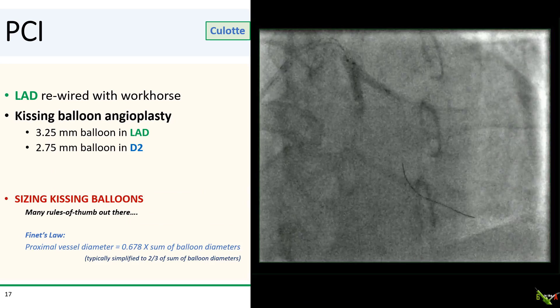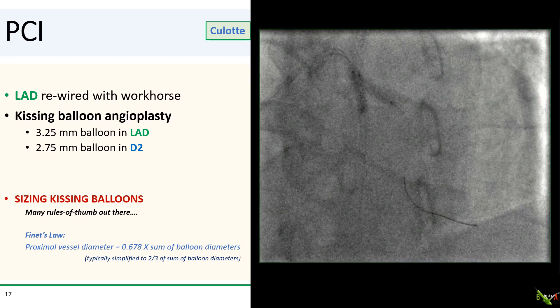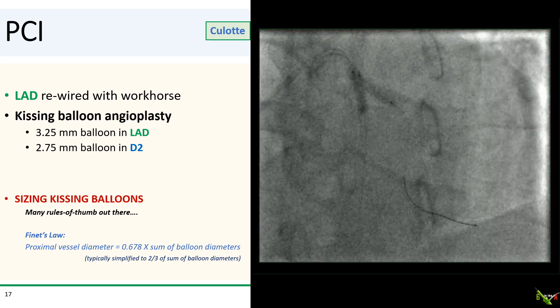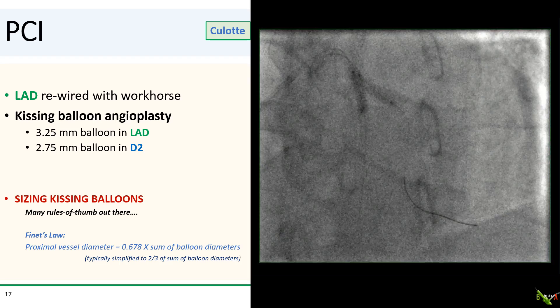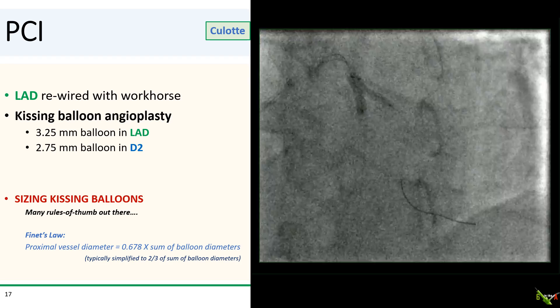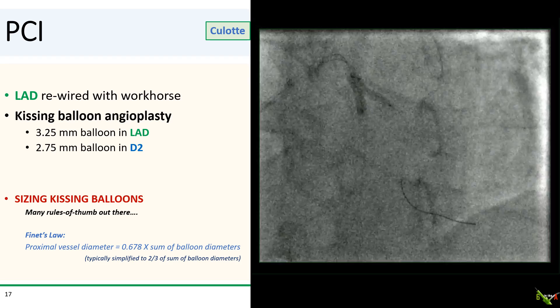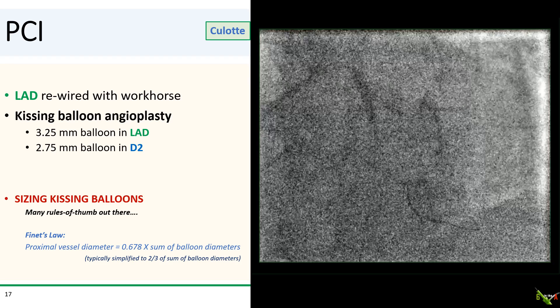After rewiring the LAD with a workhorse, we did kissing balloon angioplasty with a 3.25 mm balloon in the LAD and a 2.75 mm balloon in D2. How did we pick those sizes for the kissing balloons? There are many rules of thumb, but the most common one is probably the two-thirds rule, which is derived from Finet's law, which states that the proximal vessel diameter should be equal to 0.678 times the sum of the kissing balloon diameters. As 0.678 is simplified to two-thirds, hence the two-thirds rule.